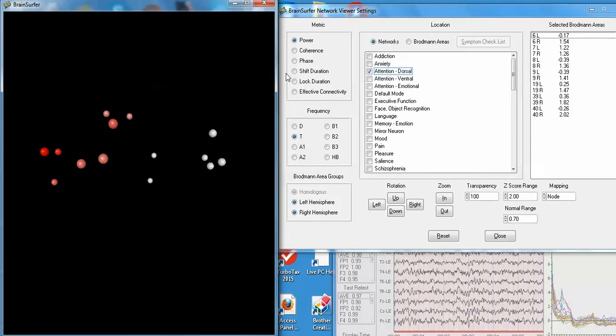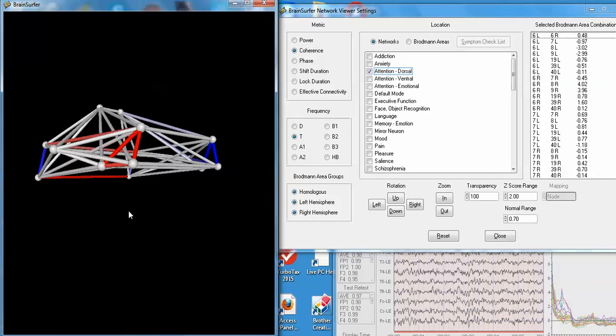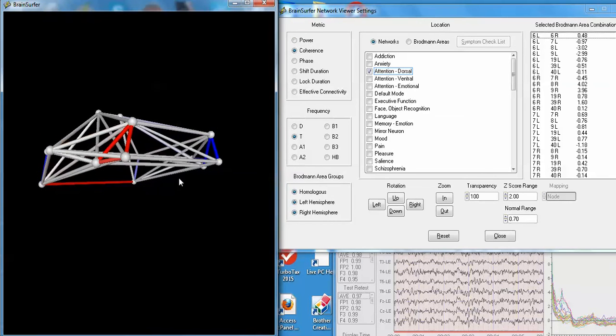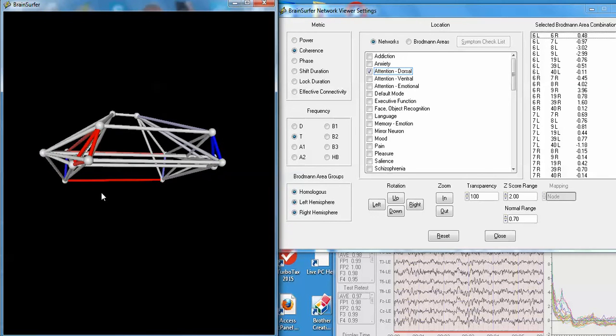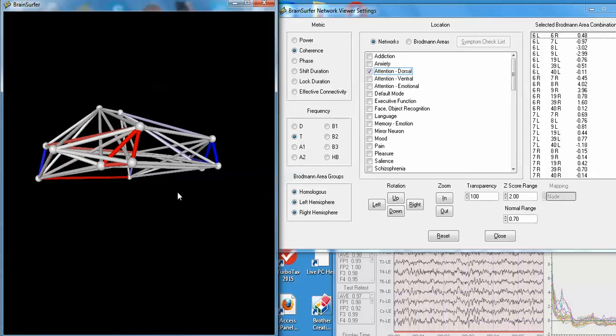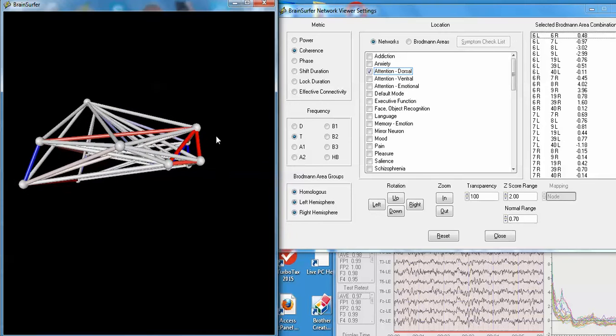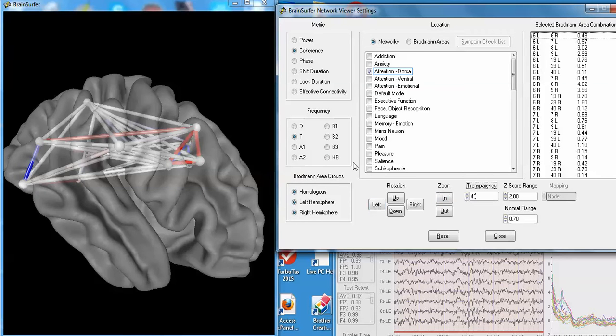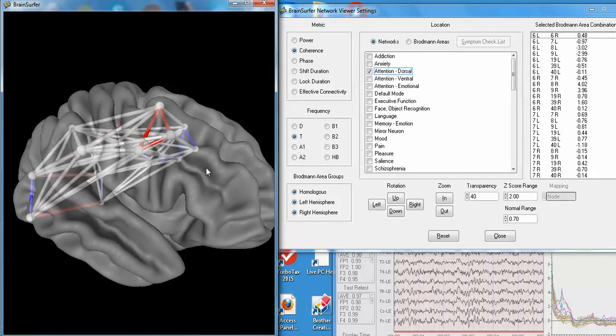And then you can move the nodes around. You can also look at the connections between the nodes by clicking coherence. This is the dorsal network for attention. The red means that there's two standard deviations, a greater elevated connectivity. The blue means reduced connectivity. We can bring back the brain so we can see with reference to the rendered brain with 40% and look at the brain in that manner.